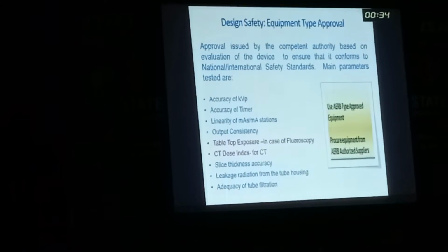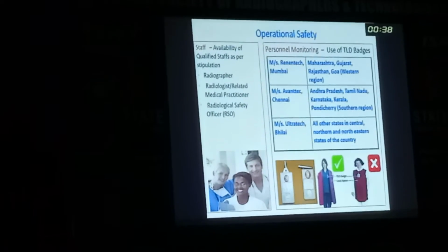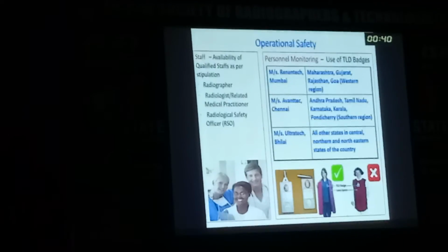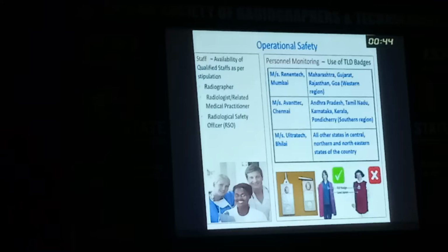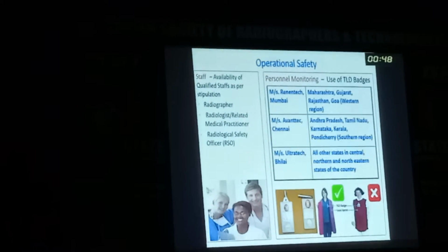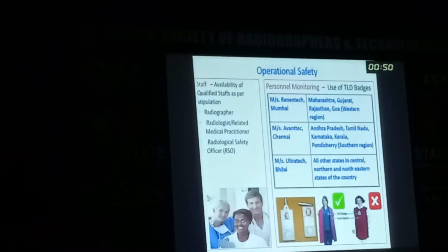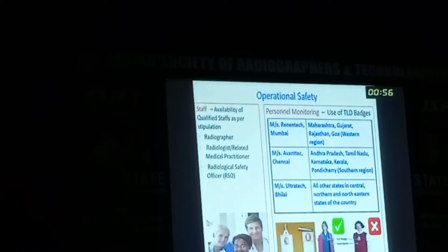And then operational safety, it requires availability of qualified staff, that is radiographer, radiologist, related medical practitioner, and personal monitoring, that is use of TLD badges. This is one of the important things, particularly for the people who are directly working with this DR equipment.